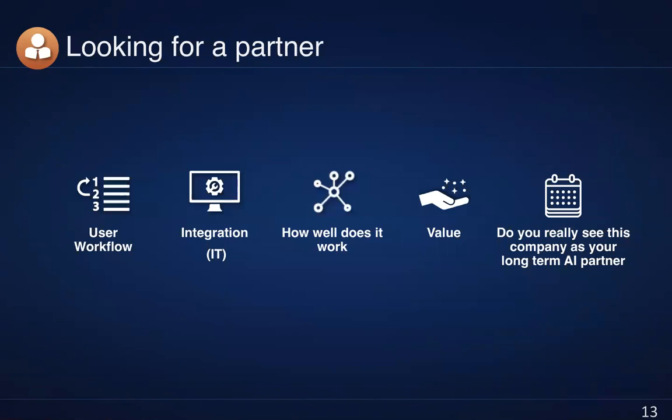The second parameter, and Mike mentioned this, and I wholeheartedly agree, is the user workflow. It has to be seamless. It has to be non-intrusive. There are a few ways to do it. It could be fully integrated into the PACS and the RIS. It could be somewhat different, but with an added functionality. But you have to look at the workflow integration and how it fits, how the user experience is.